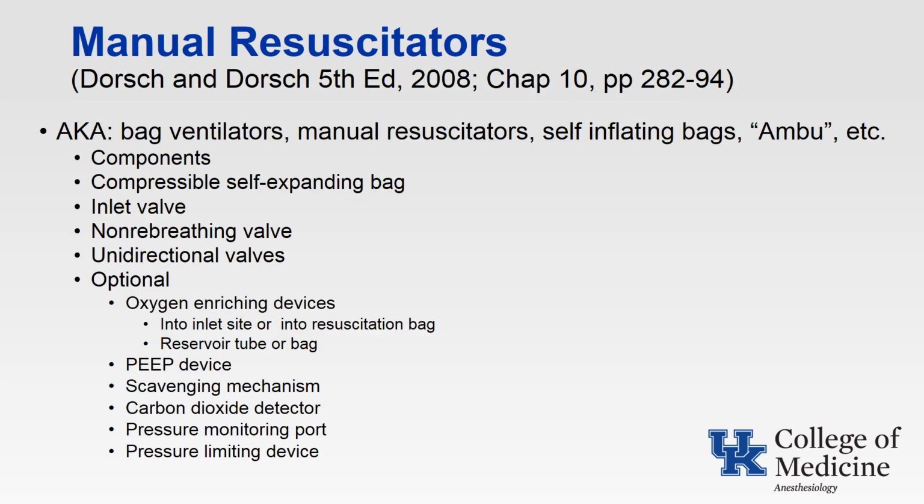The final topic is manual resuscitators. I recommend the thorough discussion of this in the Dorsch and Dorsch textbook.